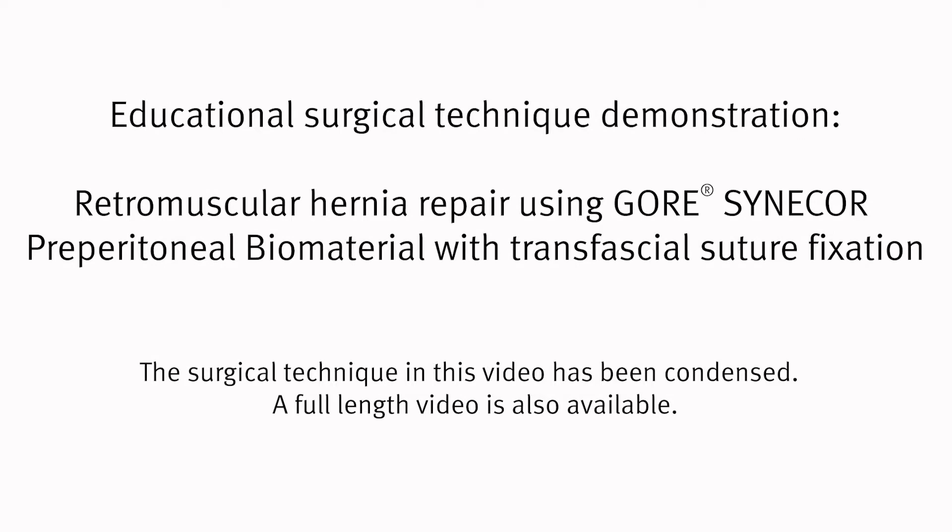This is a surgical technique video demonstrating a retromuscular repair with Gore Sinecore preperitoneal biomaterial and transfascial fixation. The surgical technique in this video has been condensed.